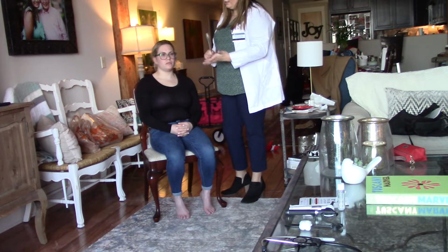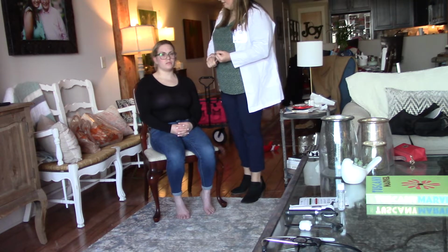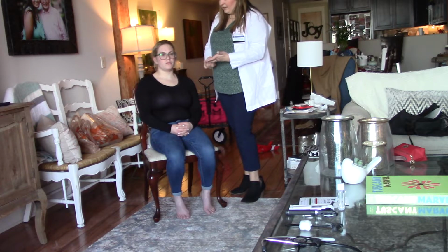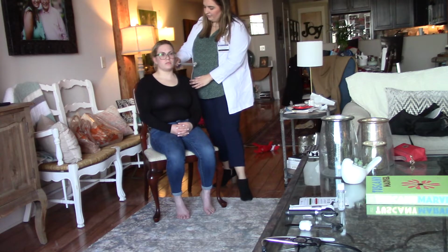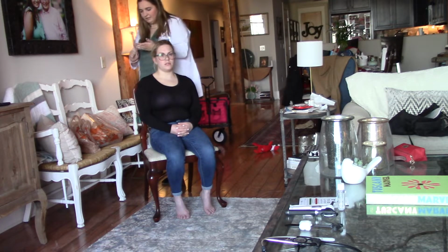I'm now going to do Weber's test for lateralization. So tell me if you can hear this the same out of both sides or just one. Both. Great. Now I'm going to do the Rinne test to assess that air conduction is greater than bone conduction. So tell me when you can no longer hear this. You can no longer hear it. Can you still hear it? Yes. Great.